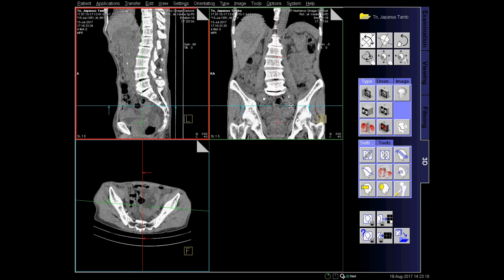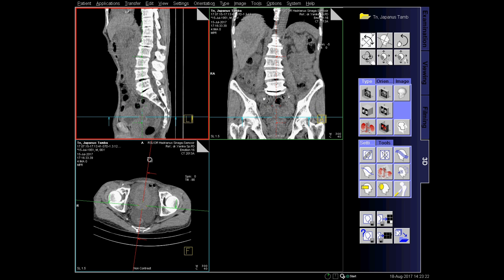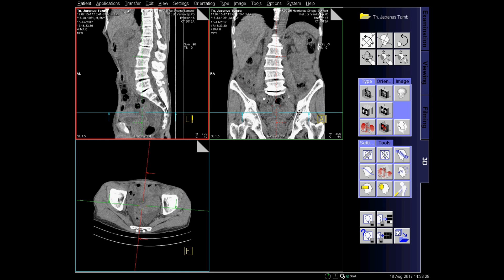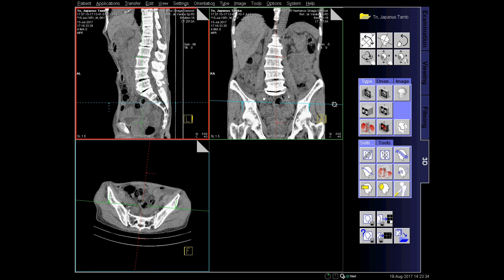In doing the work of symmetrizing the image, we are assisted by two lines — namely the vertical line and the horizontal line. We place these two lines on the anatomy of the body until the image is completely symmetrical. We can move both lines — the one in the axial cutout and on the coronal image pieces.